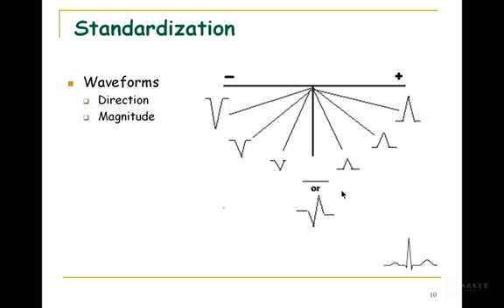So in lab, you had a positive recording electrode on your left ankle. You had a negative one on your right wrist. Most of you, if not all of you, should have seen a pretty good upwards deflection, say for the R wave. Because normally that electrical activity is running very close to parallel to that particular view of the heart, and it's upwards deflected because it's running towards the positive recording electrode.